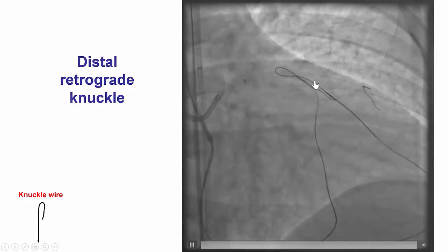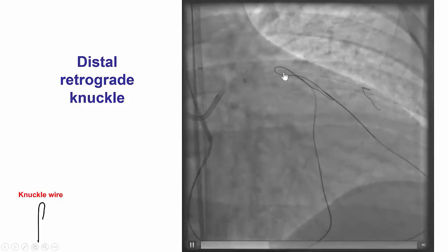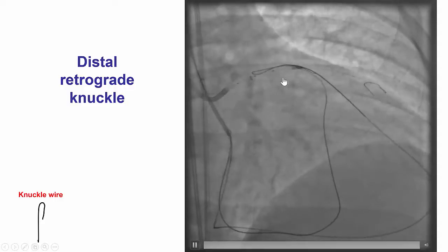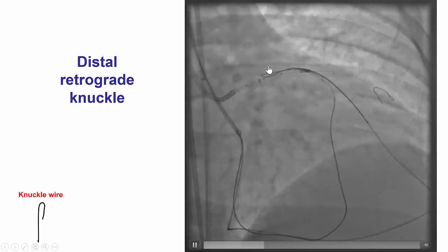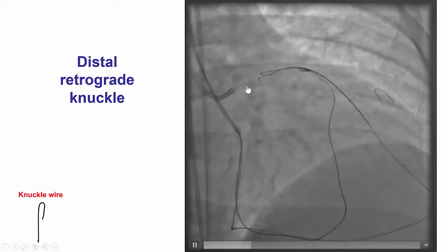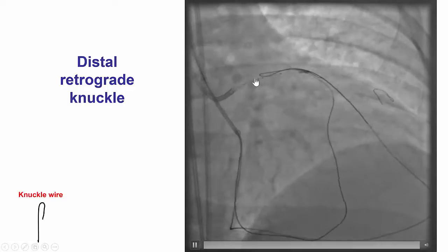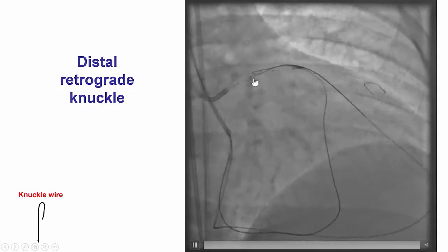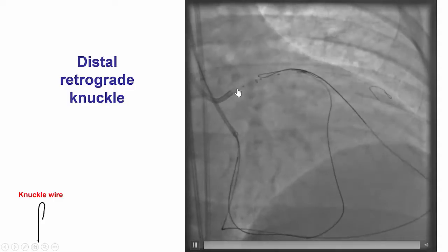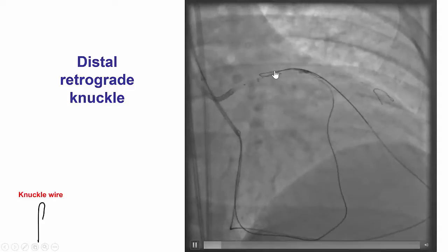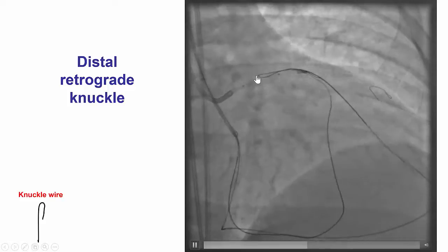The problem was that we would still have to connect to the distal LAD. Therefore, we advanced further the wire coming from the distal collateral. When the proximal LAD is involved in the retrograde crossing, it is important to protect the left main. One way to do that is by advancing a guideliner into the LAD instead of doing retrograde wiring attempts that can cause left main dissection and other problems.